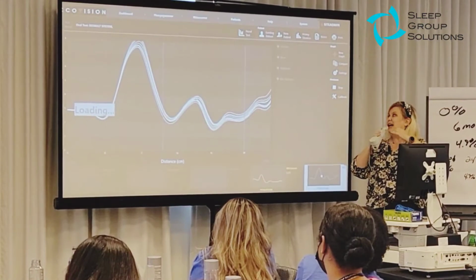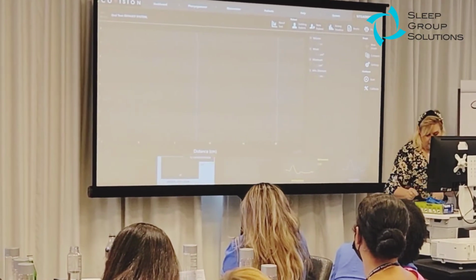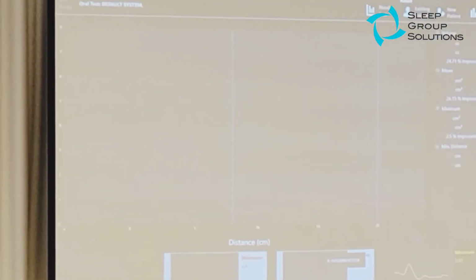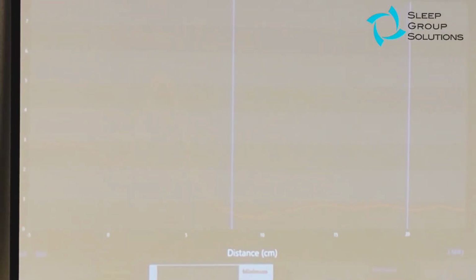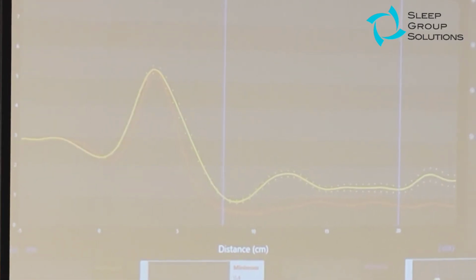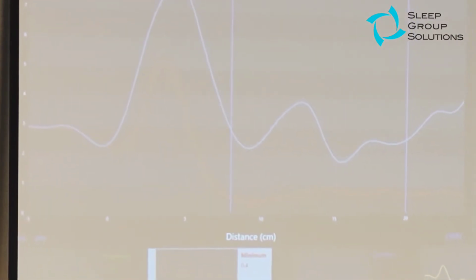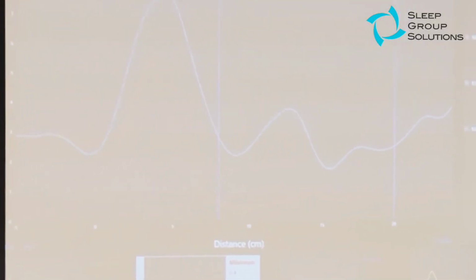That's 10 millimeters. Okay, so look. 6 millimeters. If I put them together. No, a little change. 8 millimeters over the collapse. How much improvement? Okay, 8 millimeters. I got 100% improvement at 8. Can you see it right here? Okay. 300% improvement at 10. So I'm going with 10.